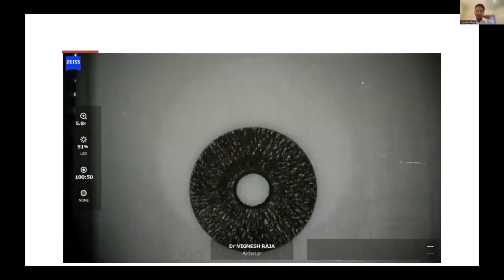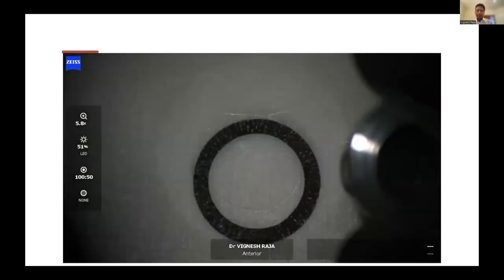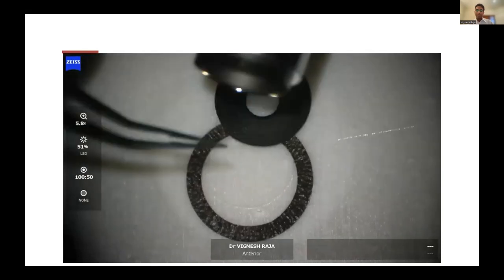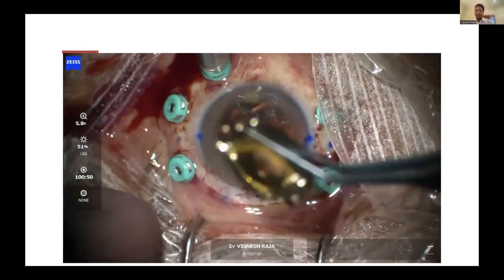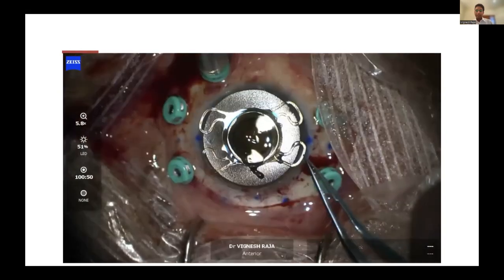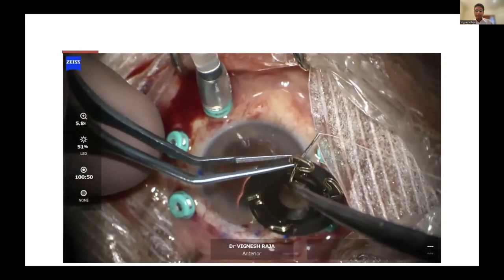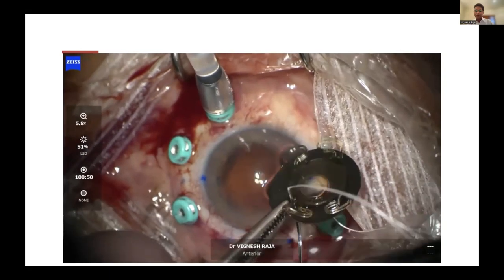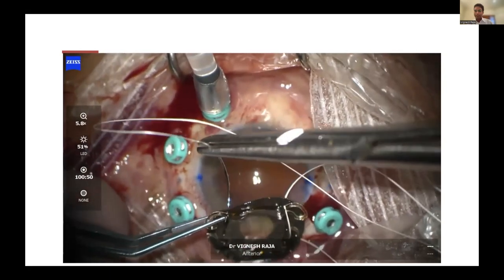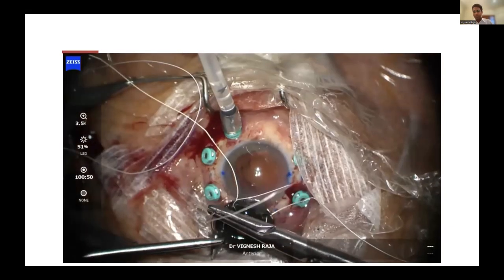So in this case, I wanted to do something different. Again, I take the trephine, you press on it with the Mooreﬁelds to get a nice circle, so that the iris sticks to the trephine. And here I'm using a Physiol Micropure lens. All I do is put a drop of saline so the iris nicely sticks to the lens. I'm now passing the Gore-Tex suture through the eyelets, but incorporating the iris also at the same time, the iris and the hole in the haptic.